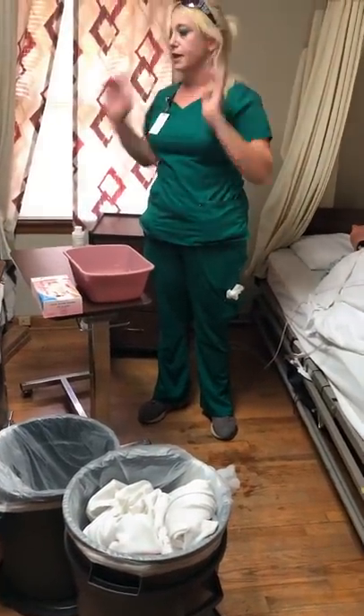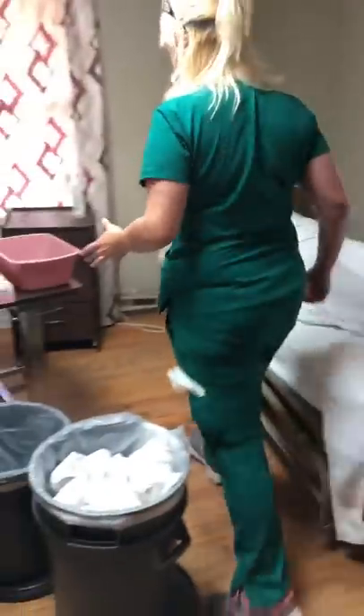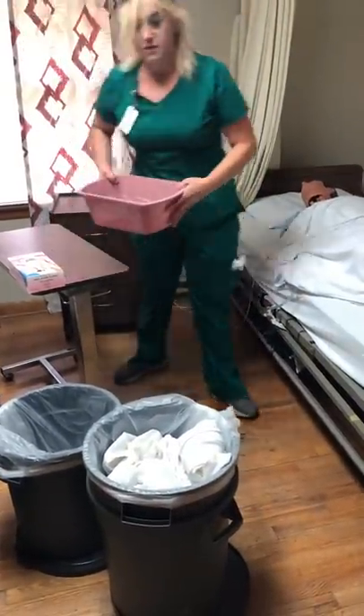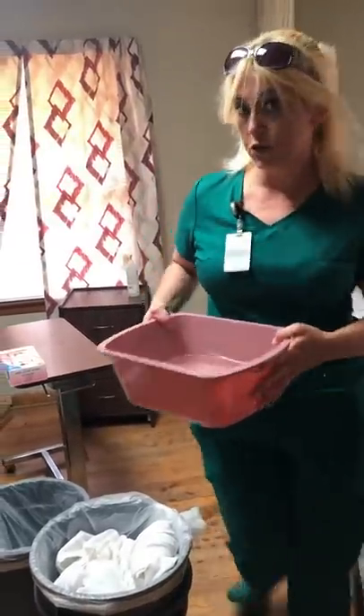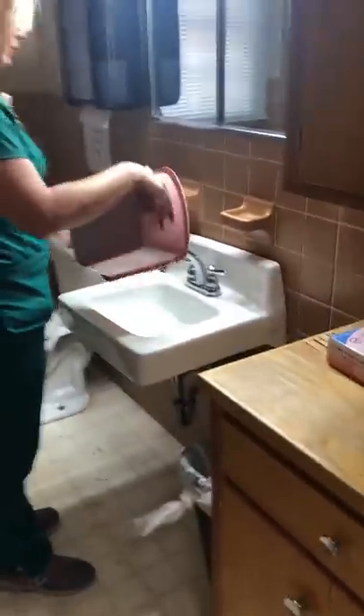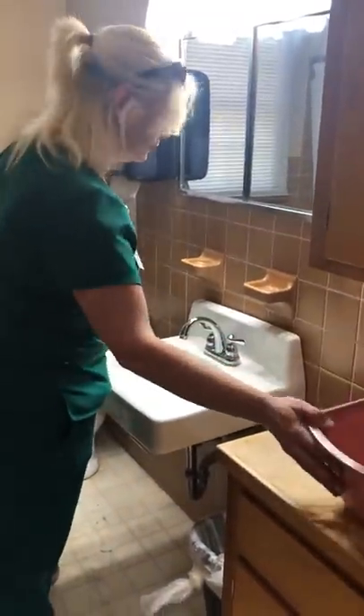At this point I'm going to take my soap and put it back in the supply cabinet. I'll take this basin with me to wash, rinse, and dry out, and then I have to do my hand washing.